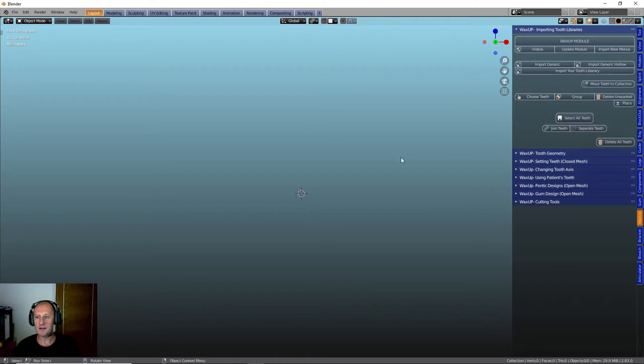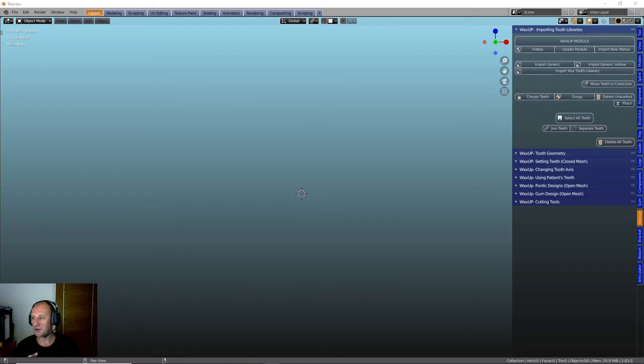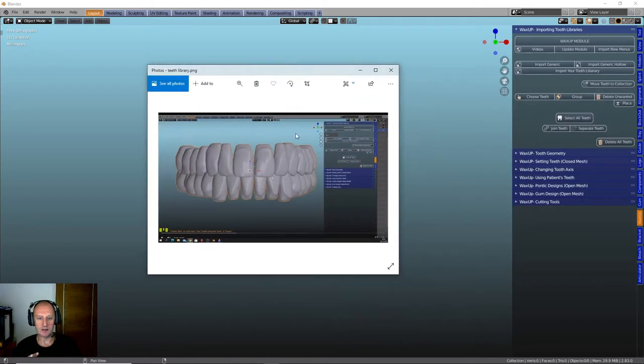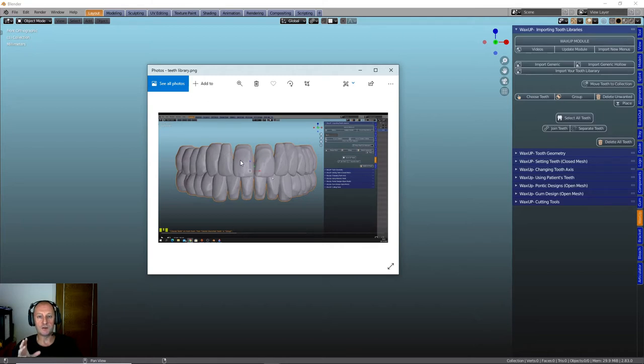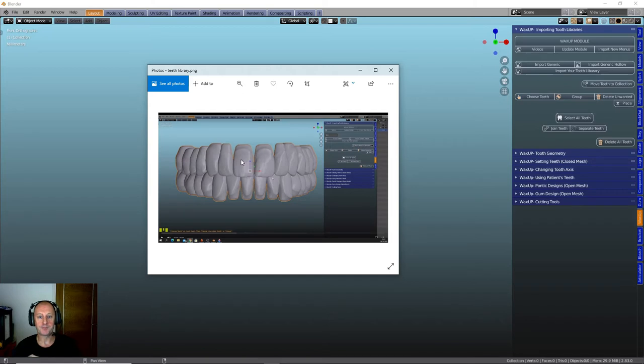First one is importing teeth libraries. Now with the module you get two libraries. You get a closed shell library and a hollow shell library of teeth. Let me just bring this into the scene there. You can see closed shell library. These are used for diagnostic Wax-Ups, Pontics and the open shell will be used for temporary crowns to be able to export them and print them.